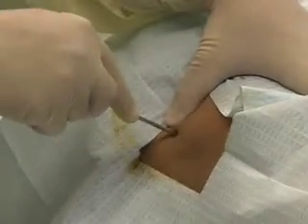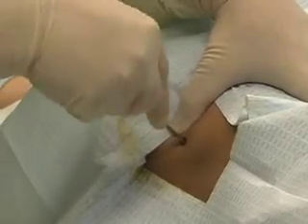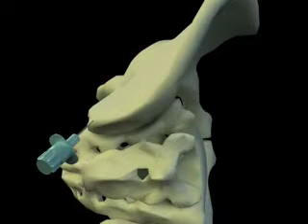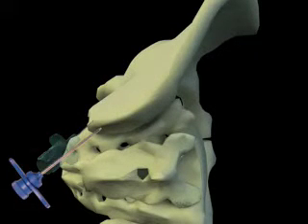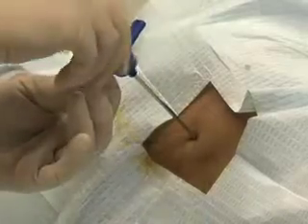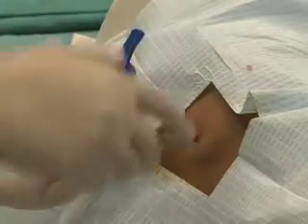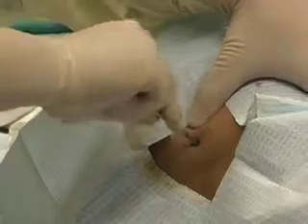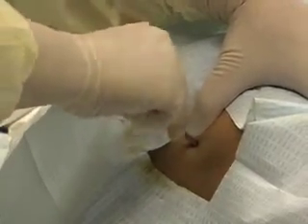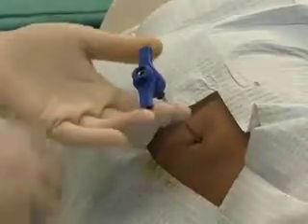While applying steady pressure, advance the needle with its stylet in place into the cortex by rotating back and forth. The biopsy needle should be inserted into bone at a slightly different angle than a previously performed aspiration. Once the needle is anchored in bone, remove the stylet. Continue to advance the needle 1 to 2 centimeters into the marrow cavity with a back and forth rotating motion. The stylet may be reinserted to determine the length of the biopsy specimen in the needle.